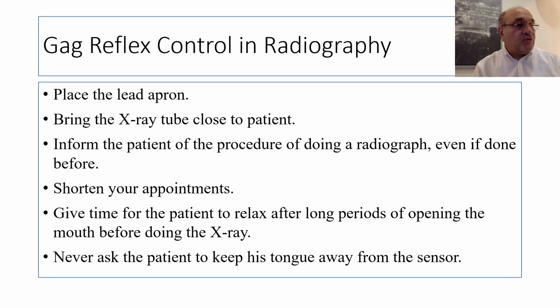What we want to do is keep the sensor the minimum time inside the patient's mouth. And this is assured by taking all the necessary steps before insertion of the sensor inside the patient's mouth.